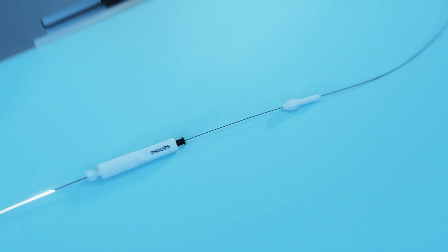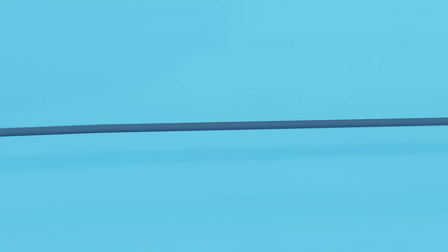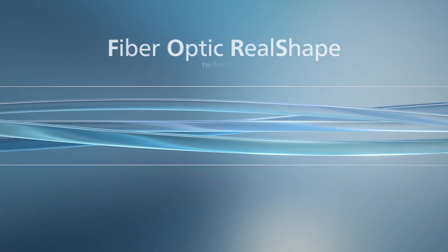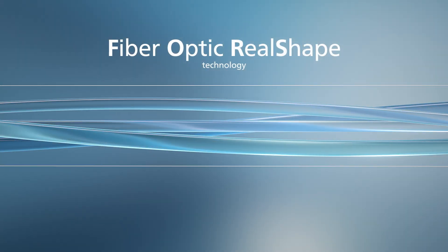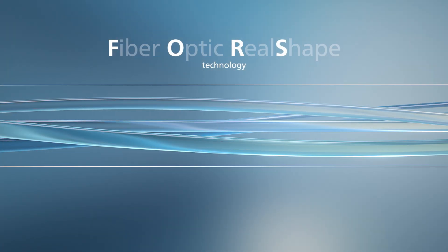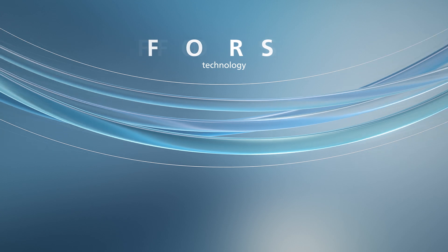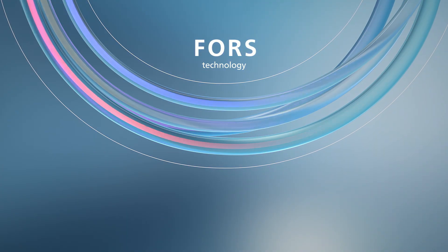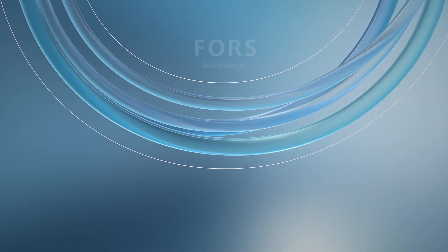Let's take a closer look. A hair-thin optical fiber with four cores is integrated into these guide wires. By measuring the light resonance change in these cores as they bend, it becomes possible to reconstruct and visualize the full shape of the guide wire.